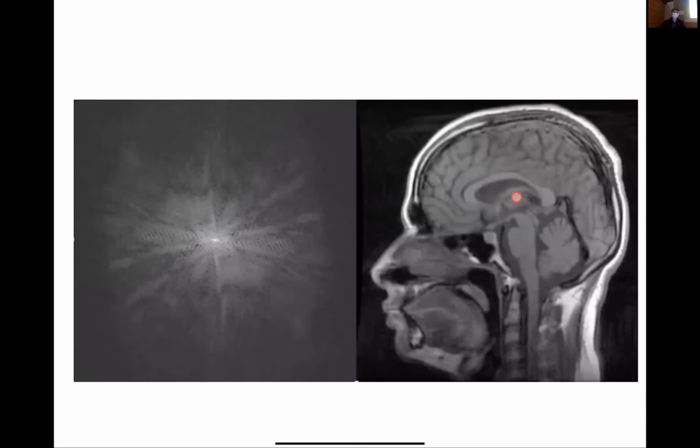This is the Fourier system, the frequencies of all the plane waves reconstructed in it, right? Yeah. So right, when we're at the beginning, we only have very low frequency plane waves, but that's sufficient to describe the overall shape. Okay. We get a little more.